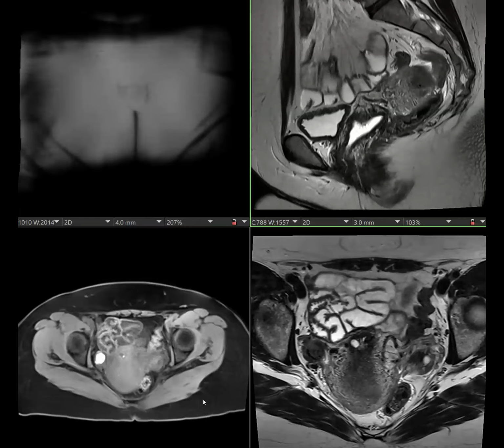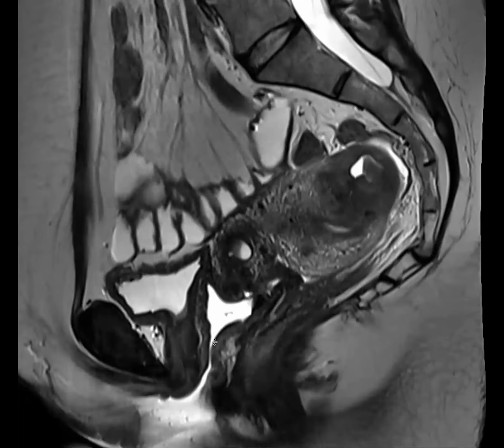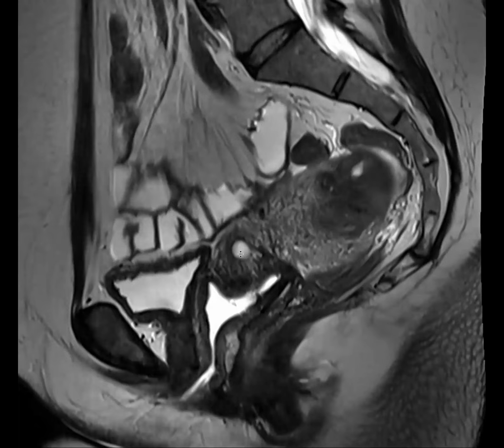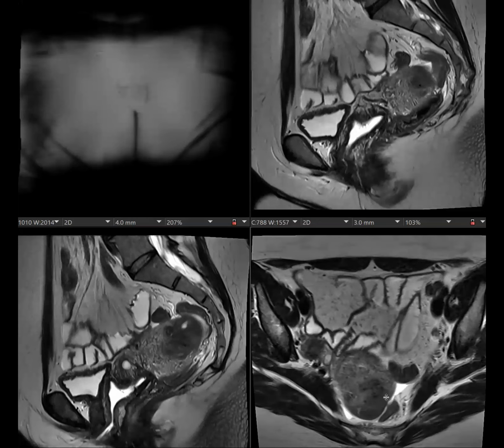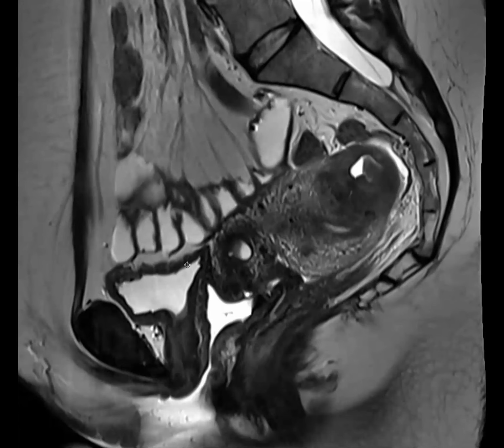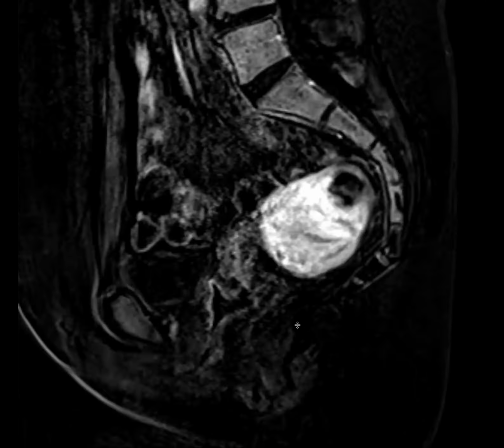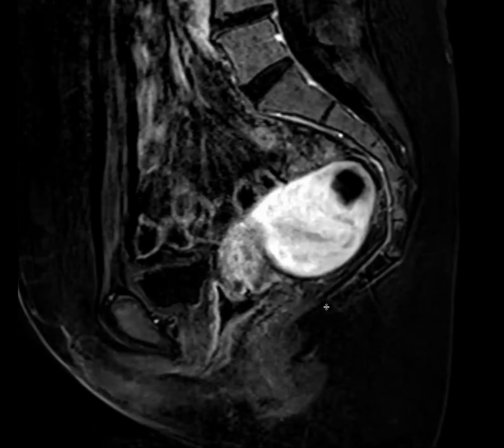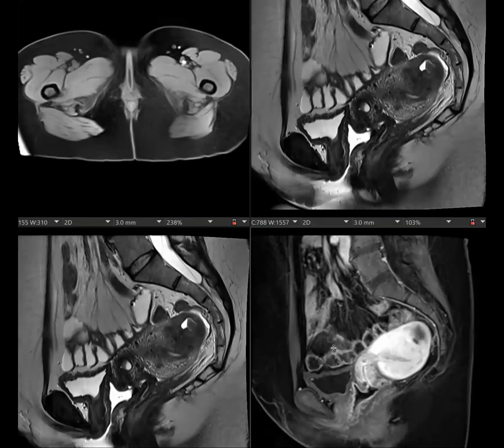Is that the cervix? No. Here's your sagittal. Were those T1 bright things corresponding to the endometrioma? No. You're talking about this thing? The T1 bright stuff, this stuff here. Oh, I see. So it's at the fundus, pretty high up. Parts of it look like it could be a leiomyoma, but then it's got these internal complexities and hemorrhage. And here's a post-contrast. Is this a cavitated uterine mass? So yes, this is an accessory cavitated uterine mass.